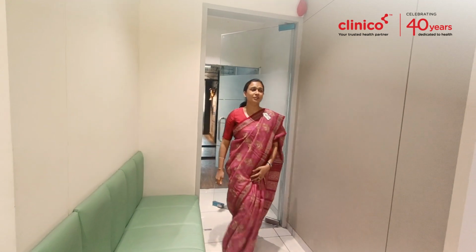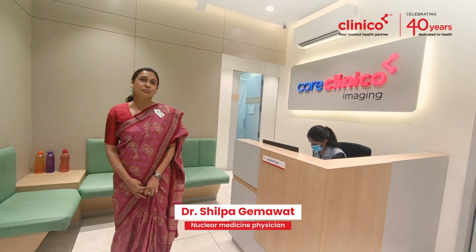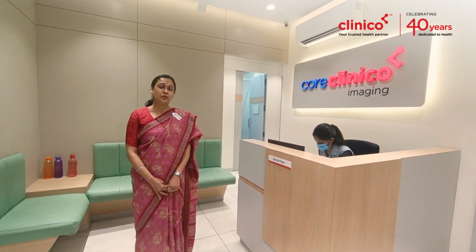Namaskar. This is our Clinico state-of-art diagnostic center where we perform all kinds of imaging: PET-CT, CT, MRI, USG and other imaging modalities. I'll walk you through our center.